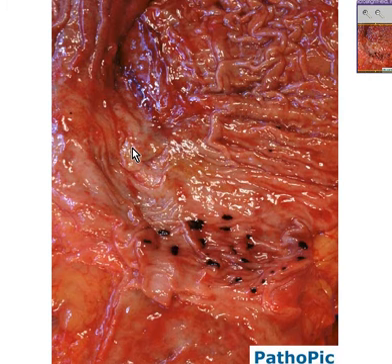Can you recognize this as being stomach? Of course you can, because you can see mucosal and submucosal folds going in a squiggly pattern, not a linear pattern like you would see with plica, but this is the rugae of the stomach.